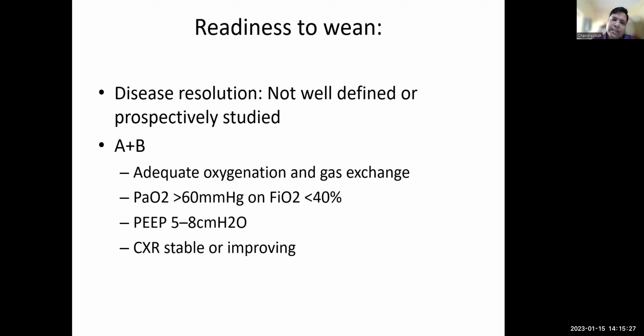Now, it is a concept which is really not very well defined: when do we say that the disease has resolved? To what extent should it resolve? Like if somebody has pneumonia, do we really need the whole process of pneumonia to get better, or should it just get better good enough that they can be taken off the ventilator? If somebody was intubated for unconsciousness, then it is probably slightly better defined, that the consciousness has improved.